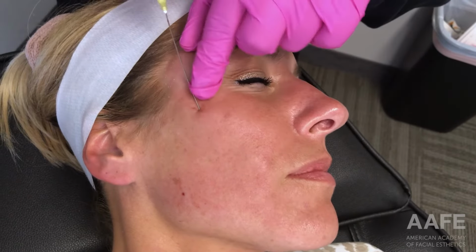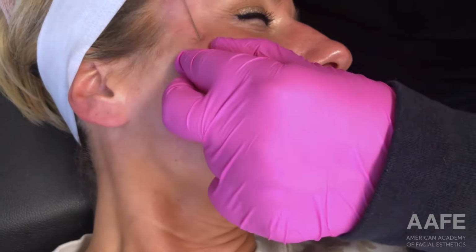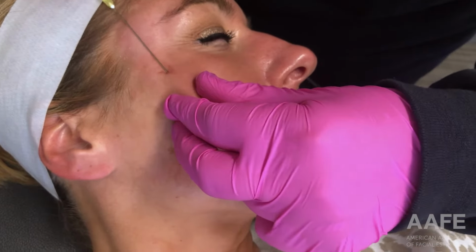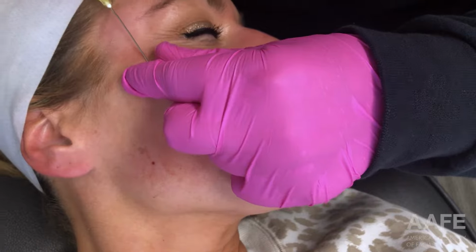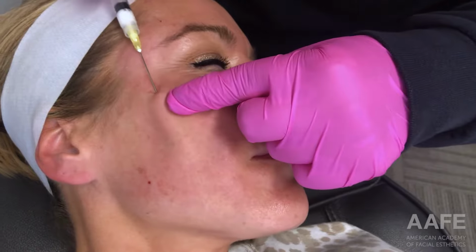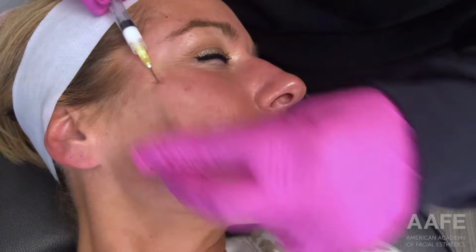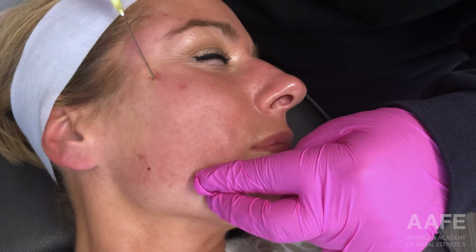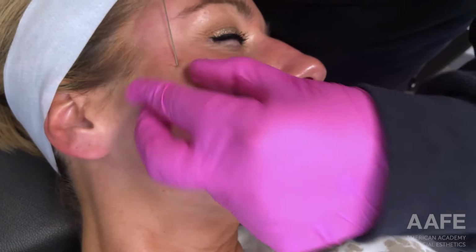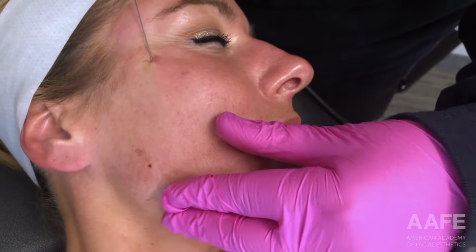So again, we're going to continue fanning this product in, and then she'll be done. We'll give her a nice gentle massage when her treatment is finished, just to make sure that the product is nicely integrated. And that's all. The patient is not required to do any form of massage after the treatment, unlike some other biostimulatory products. Other than our massage post-treatment, she is not required to do any massage moving forward, which is great. Patient compliance can be a challenge if it's requiring a lot of massage or things like that post-treatment. And so for this, she doesn't have to worry about any of that.